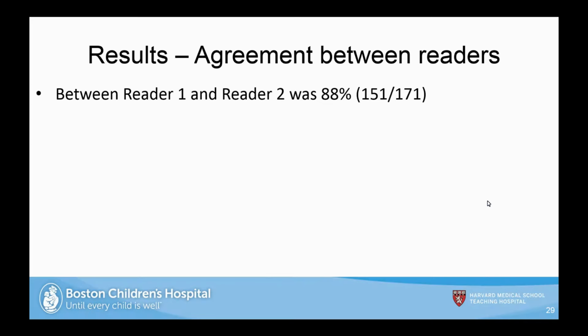what they want to be able to do is help the technologists flag non-diagnostic cases. But in this case, the algorithm's not even 95% accurate. So it would probably help them a little bit, but there still has to be a user there watching the cases and saying, well, this is non-diagnostic, and maybe having the algorithm confirm that. So I think that's what I got from the paper.